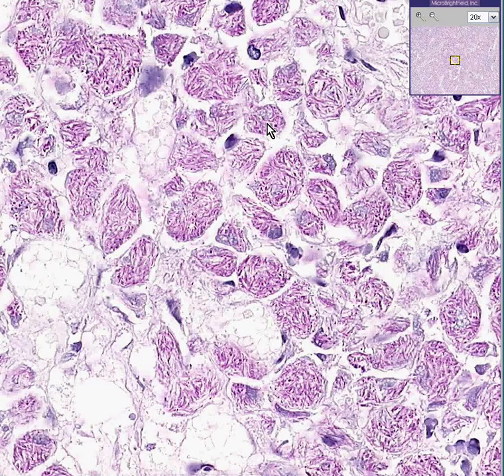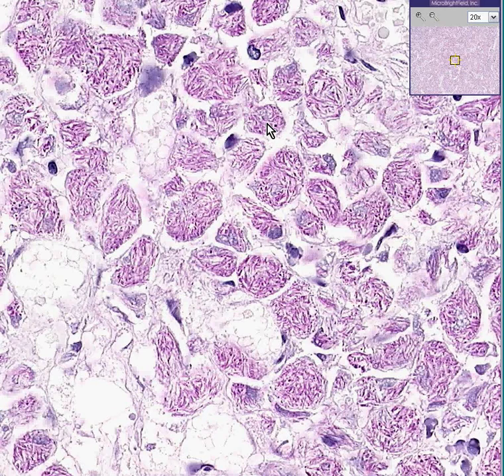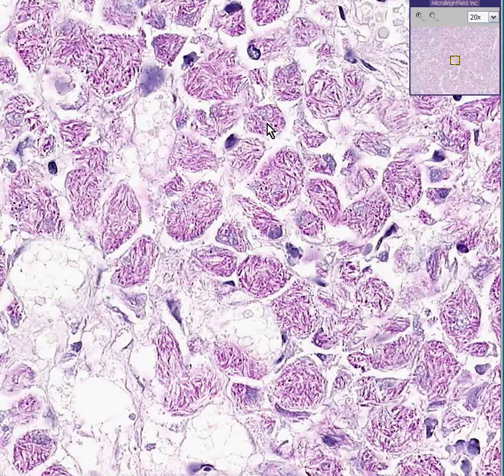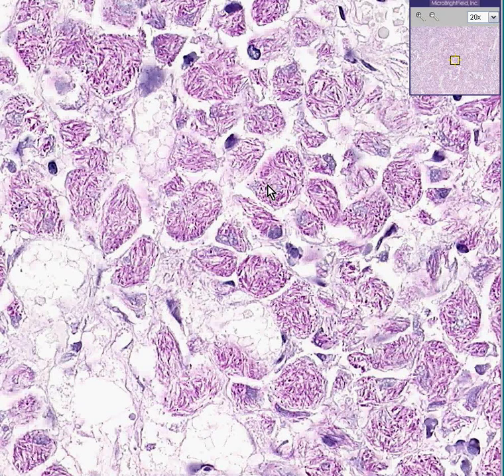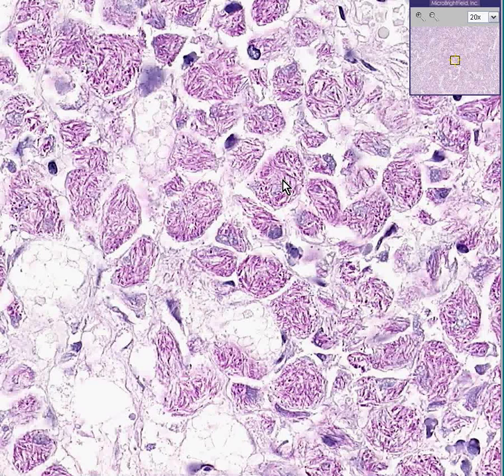But this is the most common type of atypical mycobacteria, and also the most important because it is rampant in AIDS patients and has to be treated just like tuberculosis. This is MAC — mycobacterium avium intracellulare — because the organisms are all intracellular within the macrophages and they stain with the acid-fast stain. Similar to TB, they look a little bit longer. This is sometimes called mycobacterium avium intracellulare complex, or MAC complex.